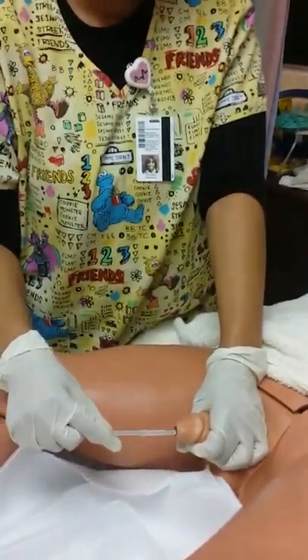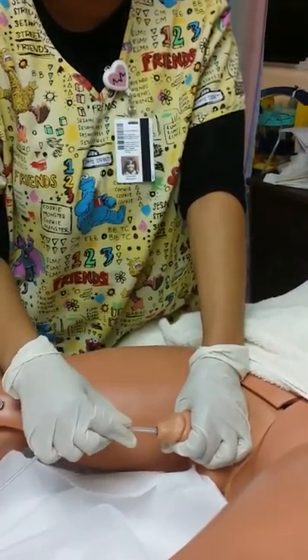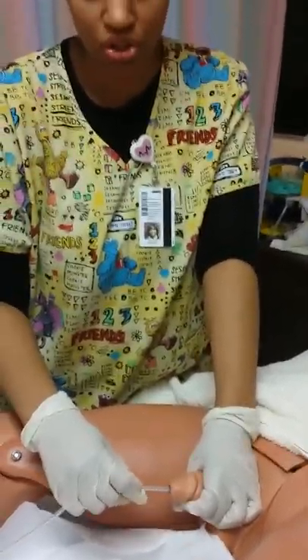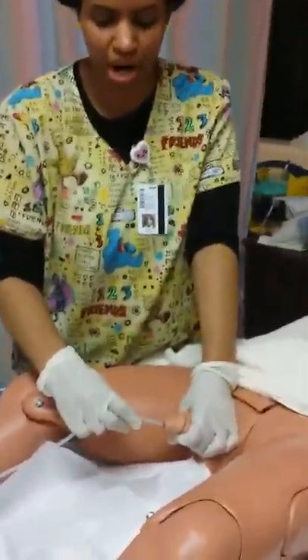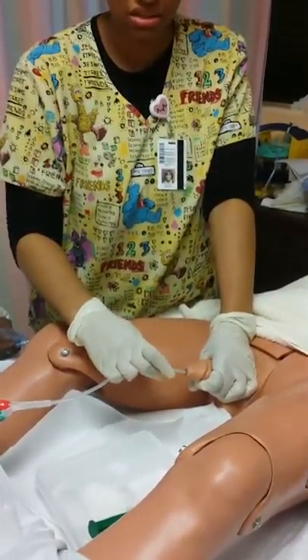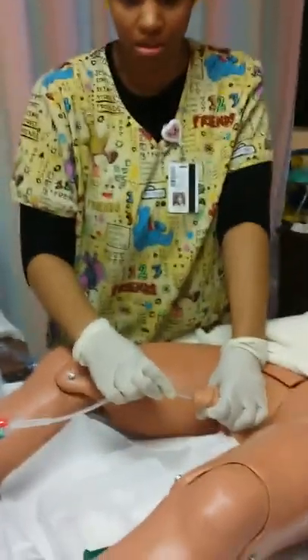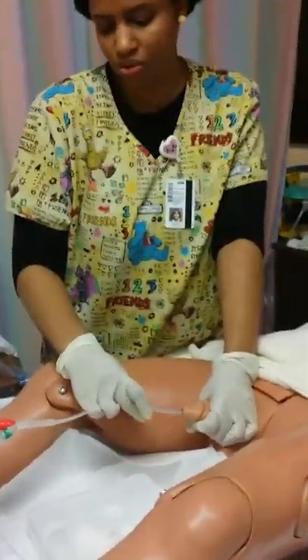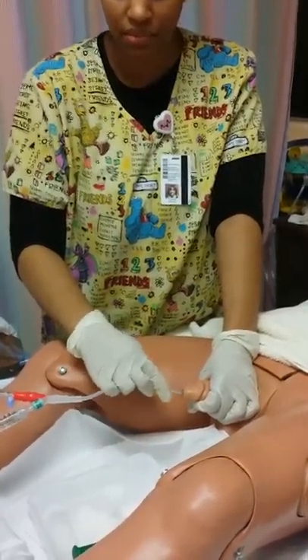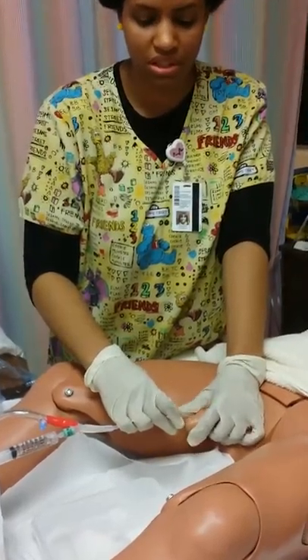Okay. So I'm going to go ahead and insert it. Kind of wiggle it a little bit in there, and try not to be too forceful, but kind of making it a smooth process. So I'm going to keep going. And with a man's penis, it's normally a little bit further than a woman's. So I'm going to go, like I said, 7 to 9 inches until I see urine. So we're going to say I see urine. So we're going to stop.